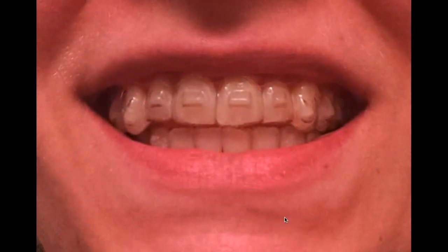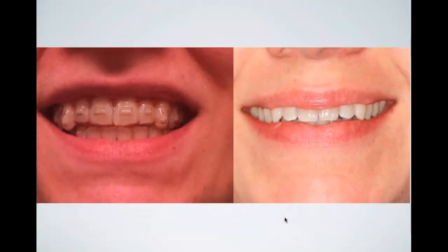What excites me is the aligners coming out. One of the biggest challenges with aligners is the aesthetics, right? If people couldn't really see them, then aligners would be what everybody would want. The challenge is that people do see your aligners. You have to put attachments on teeth, and then people see them. So the 3D printed aligners that are coming out now, that's what I'm most optimistic about, because it allows you to change the property of the aligner in very specific spots of the aligner itself.